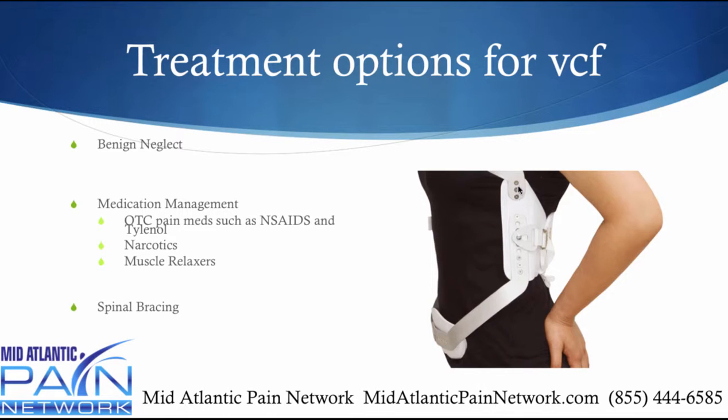Here's a typical brace. There's actually a point of compression up here over the chest, one in the back and one in the abdomen. That's called a Jewett brace, and it's been pretty effective over the years. There's also one that goes all the way around called a TLSO, and that's got a ton of support, but it's also a lot more bulky.